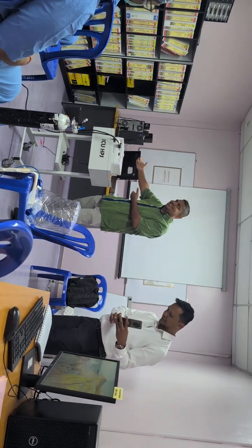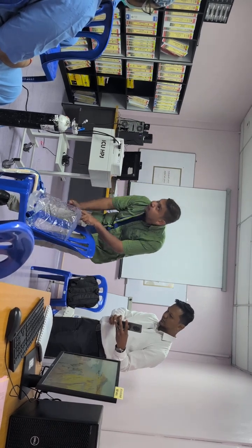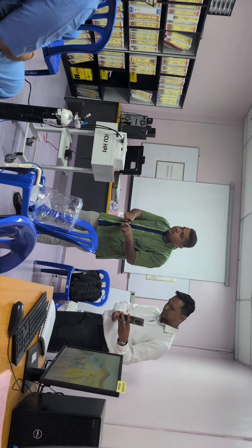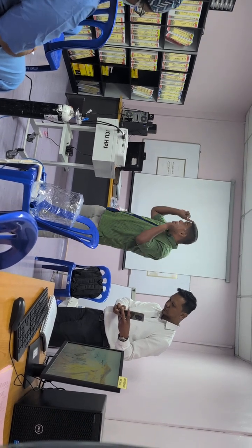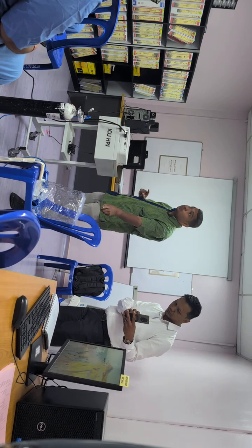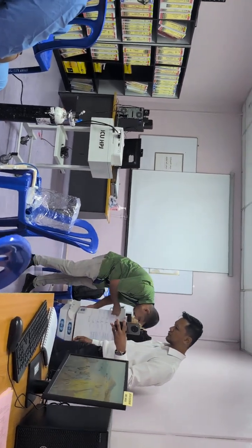Okay, now you see this dead space. This cannot be used as a BPAP or with any of your machines, because the dead space is way too big. Hence, there is another version.